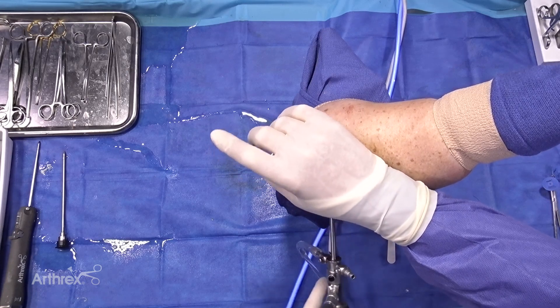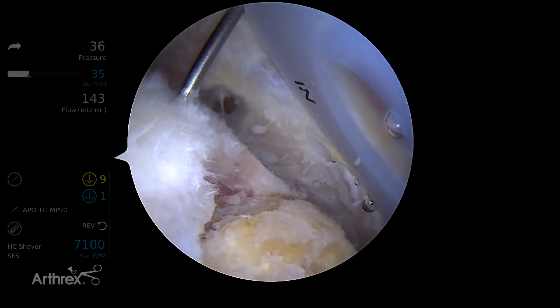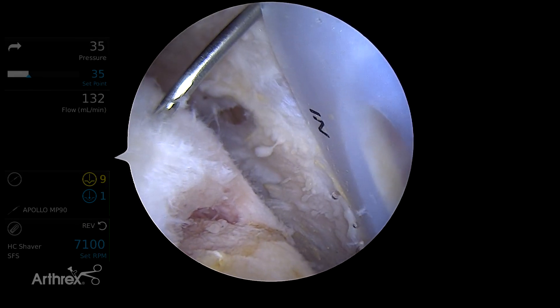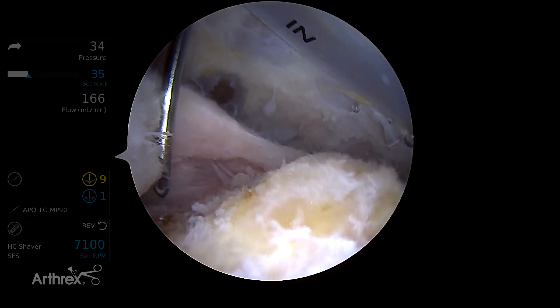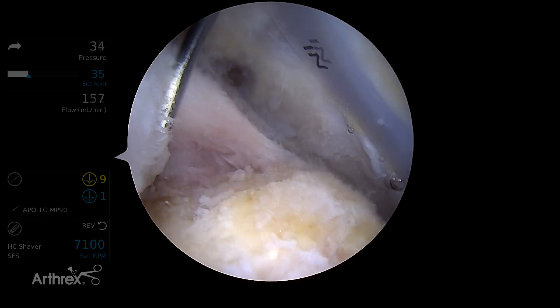This is a right shoulder. We've got a rotator cuff tear involving supraspinatus and about half the infraspinatus. I've got a lateral working portal with a passport, a posterior portal with a passport, and a posterior viewing portal at this point. And I'm making an accessory lateral portal just with a percutaneous stab wound here to place my anchors.